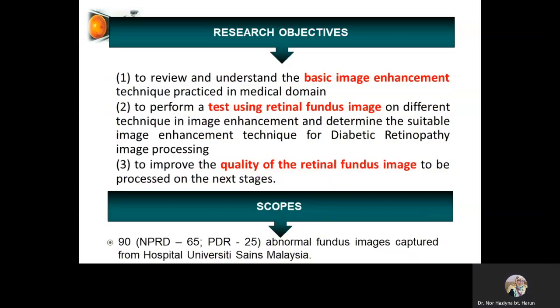Okay, for the scope of this study, we use 90 abnormal fundus images captured from Hospital Universiti Sains Malaysia, 65 for NPDR and 25 for PDR. This is NPDR, not a typo.